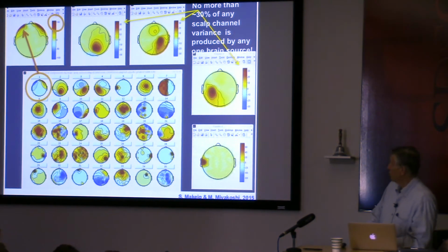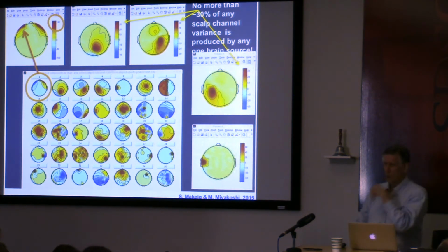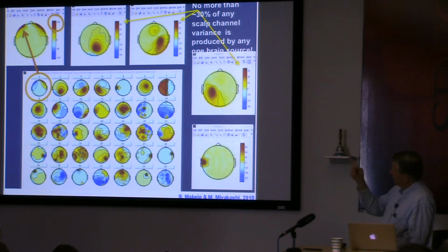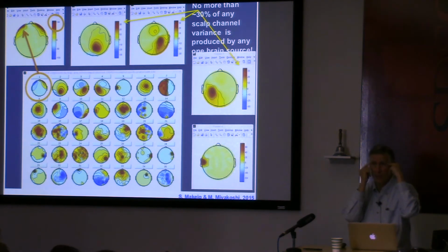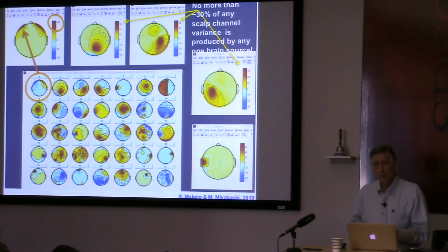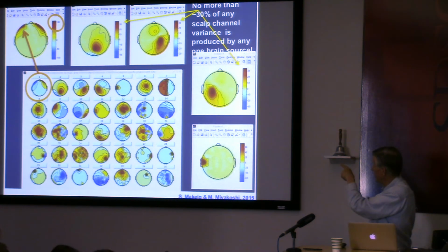And here is even more so. The subject was making lateral saccades, left and right, whose projection to the scalp is shown in component 1 there, the map, and its percent projection to the scalp channels goes as high as 100%. So if you put electrodes near your eyes, almost all the signal comes from eye movements, and that's why they're called EOG electrodes. But not all the signal comes from there, right? So you'll see them represented very smoothly and cleanly in other component processes.